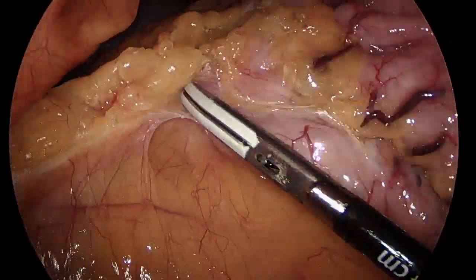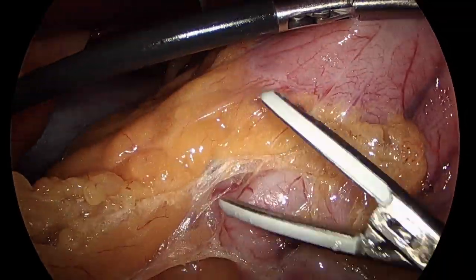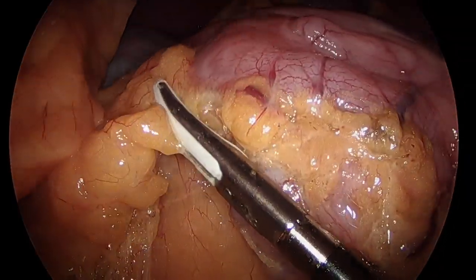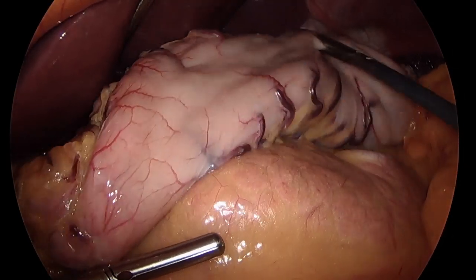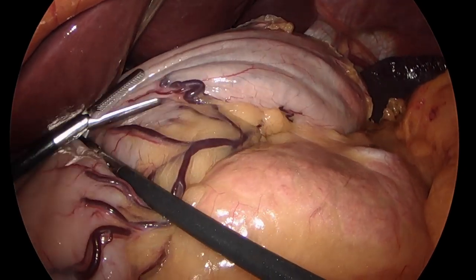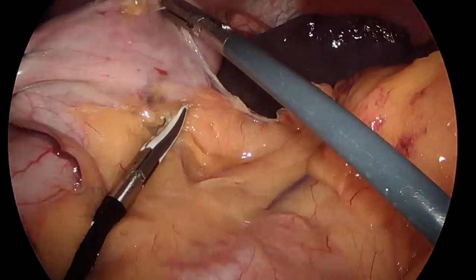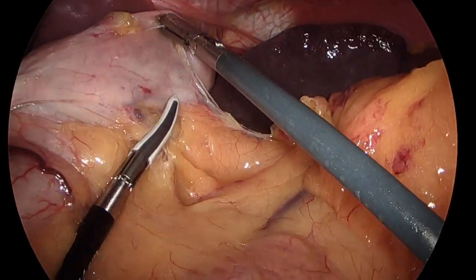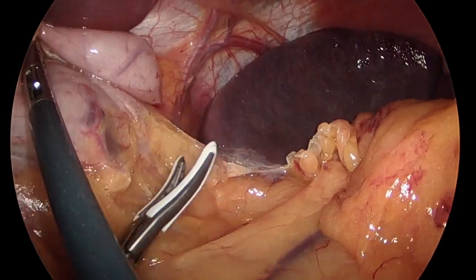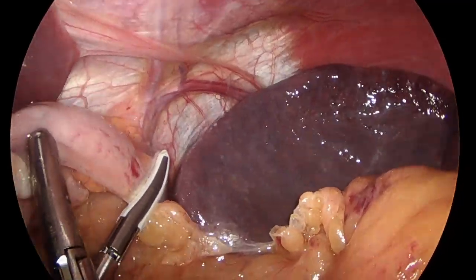Our dissection is carried as close to the pylorus as possible to ensure we will have enough of the distal stomach free from adhesions for our first staple fire. Now with the distal stomach mobilized, we can adequately retract the fundus anteromedially in a spiral motion while pulling into the trocar to gain appropriate exposure and tension for the remainder of the dissection. The superior splenic pole vessels are coagulated and divided during this step by first coagulating the posterior short gastric artery and working in a cephalad manner until the final superior splenic vessels are coagulated and divided without undue tension on these vessels, which may cause unexpected bleeding if accidentally torn.